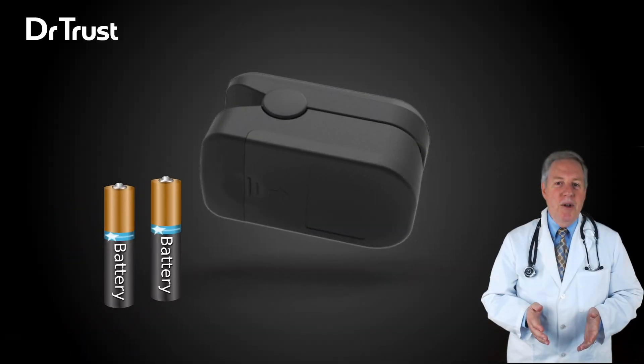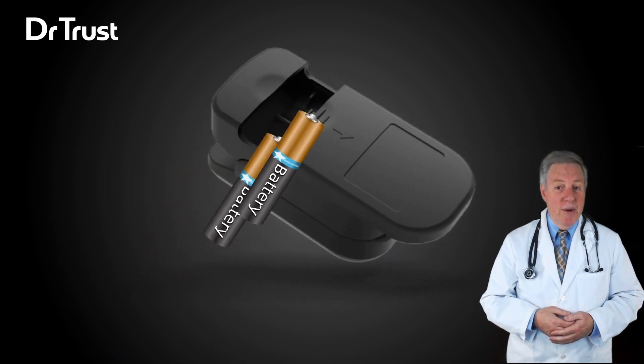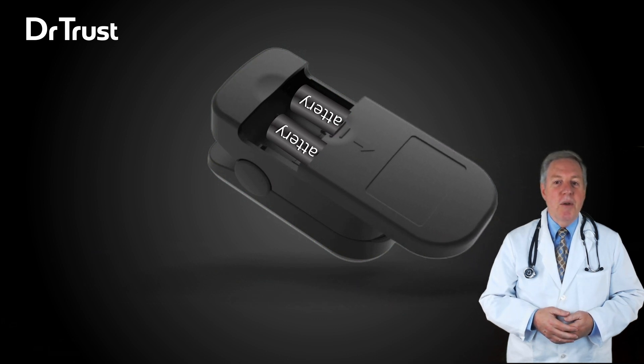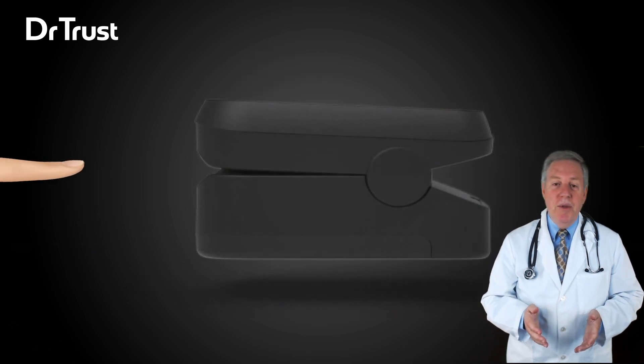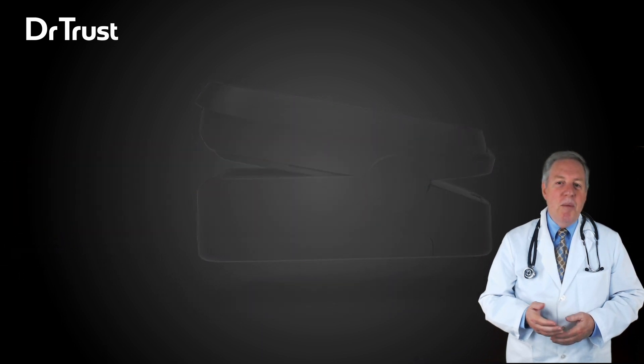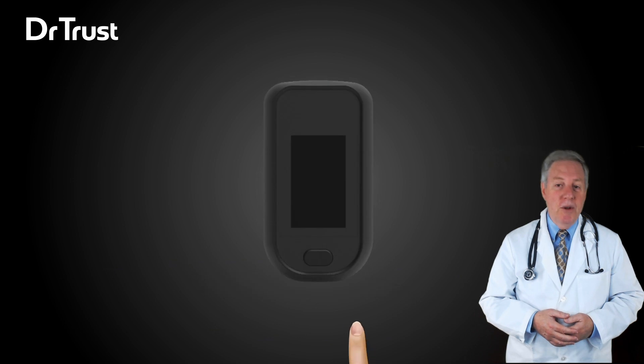Starting the product is easy. Simply insert two AAA batteries in the correct polarity and put the cover on it. Put one of the fingertips into the rubber hole of the oximeter with the nail surface upwards and release the clamp. Press the power button for two seconds to turn the pulse oximeter on.